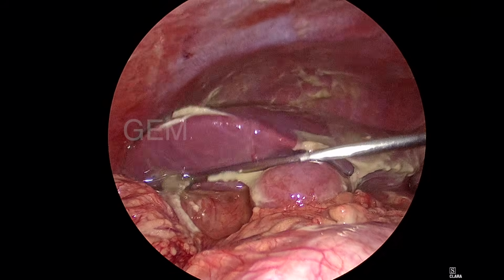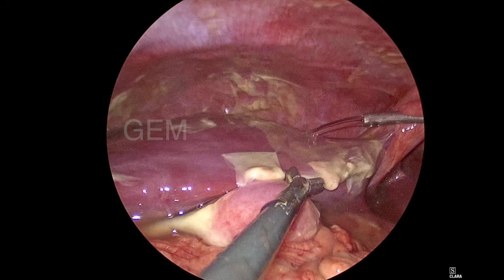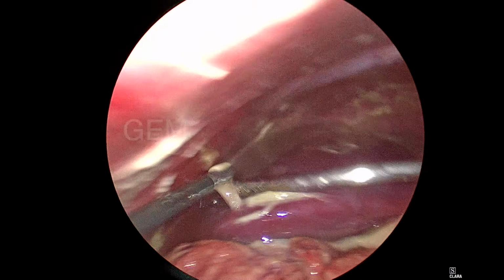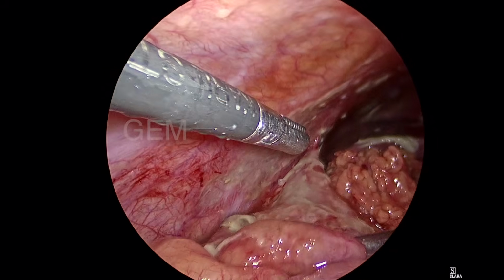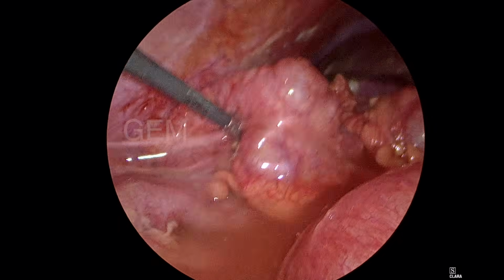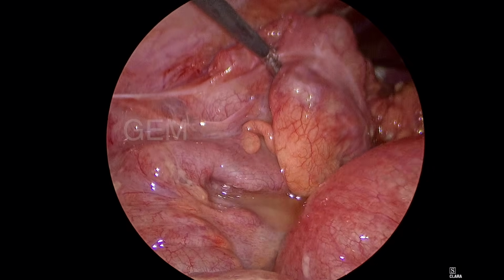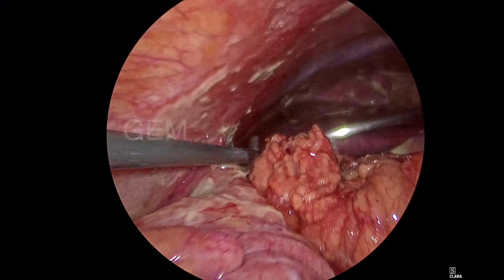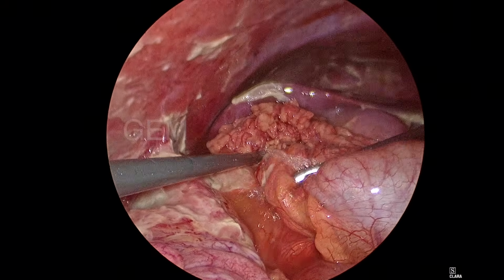Usually it comes in a 1 liter plastic bottle. They put it in a warmer, so it will be warm saline, and 4 or 5 liters is the minimum required to wash all quadrants of the abdomen. First give a thorough wash to reduce the bacterial load, then do the procedure. Finally, again you have to wash.